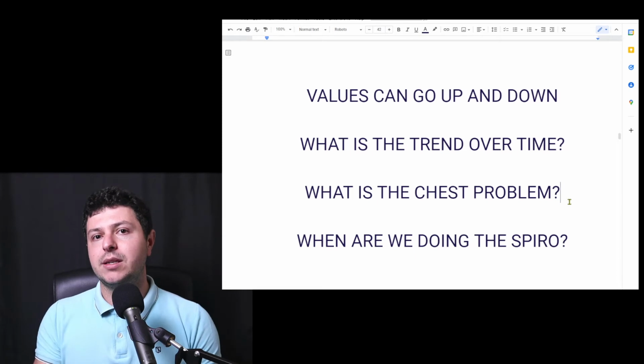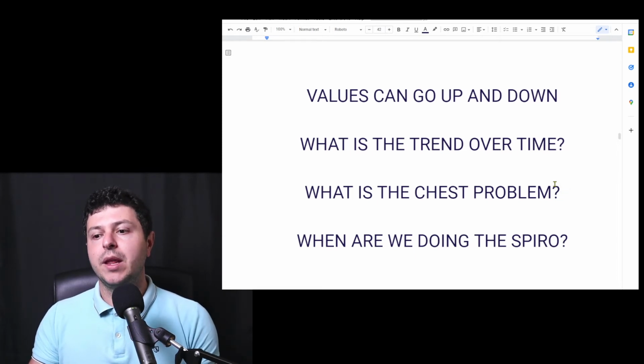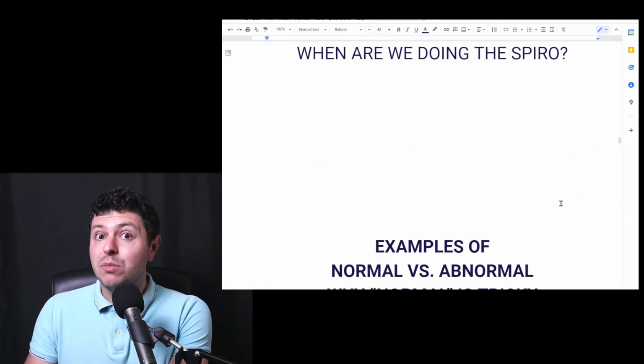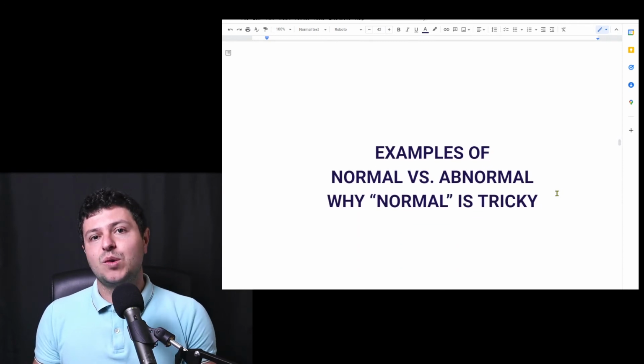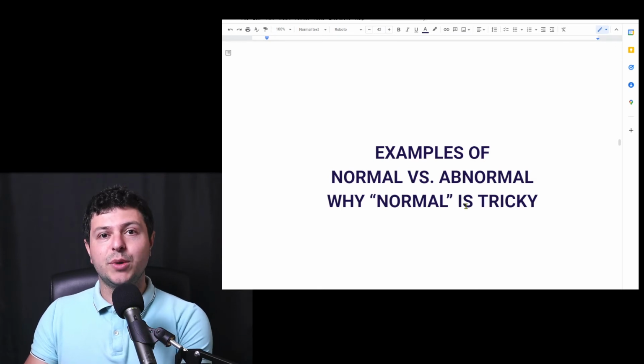But then 2 months later, it may be back to normal completely, back to the baseline. So these things are very, very important when we're trying to figure out what spirometry means. And I'm sorry this video is already very long, but I think it's quite important to understand what's going on. Let's talk about why normal is tricky.